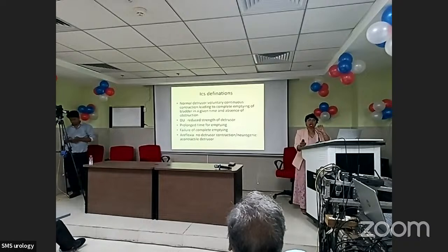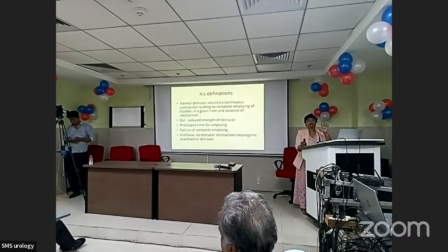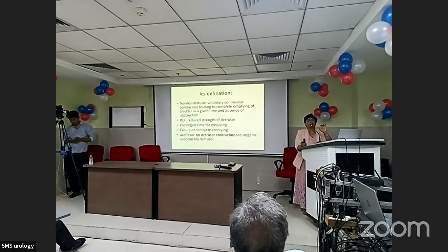DU, the most important part, is detrusor underactivity. On this, all the problems start in urodynamics, because this has many implications. We are not able to understand this properly, completely, and this is the only scenario which we face in practice, which can cause us problems.